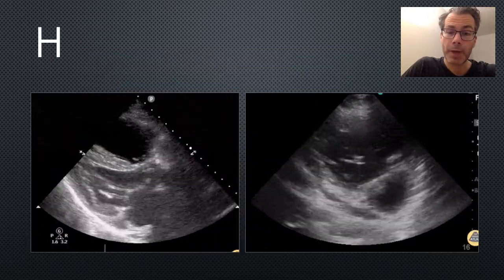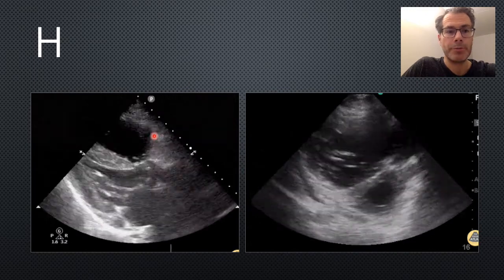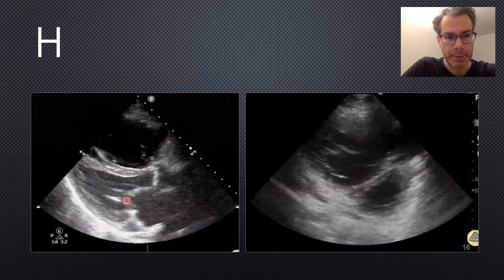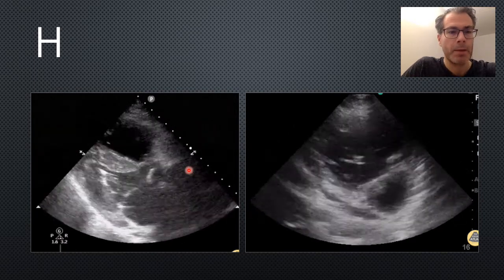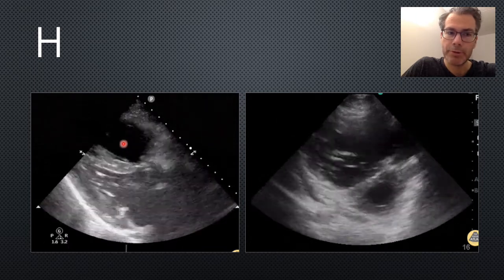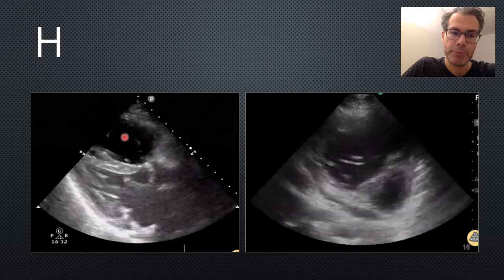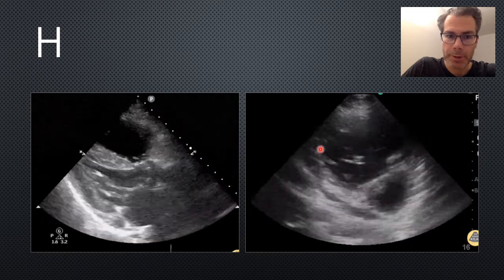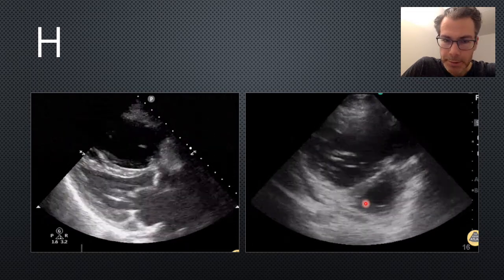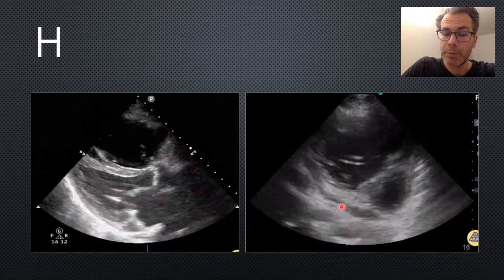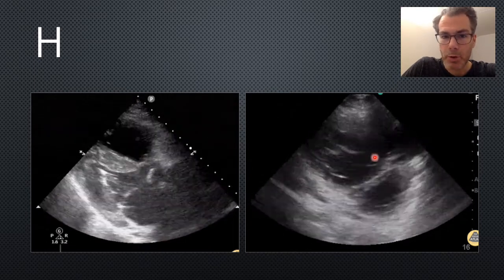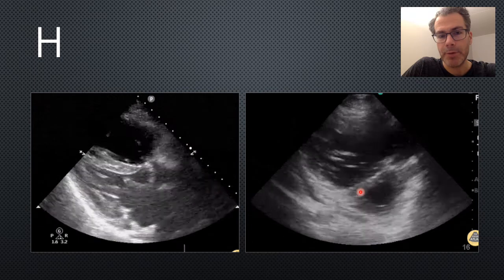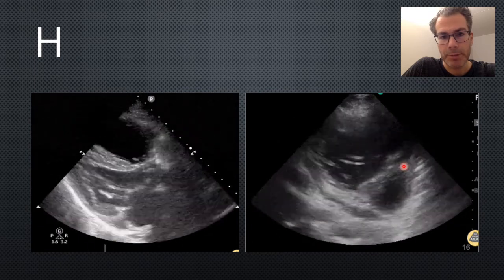The second thing we look for in the heart is RV strain. On a parasternal long axis view, you can see the RV is massively dilated, really crushing the LV below it. On parasternal short axis, the RV is enormous and the LV is tiny. We also see septal flattening — normally the septum should be convex and the LV round like a donut, but here the septum is flattened and the LV takes on a capital D appearance, known as the D sign. For more on POCUS and PE, check out my other video.